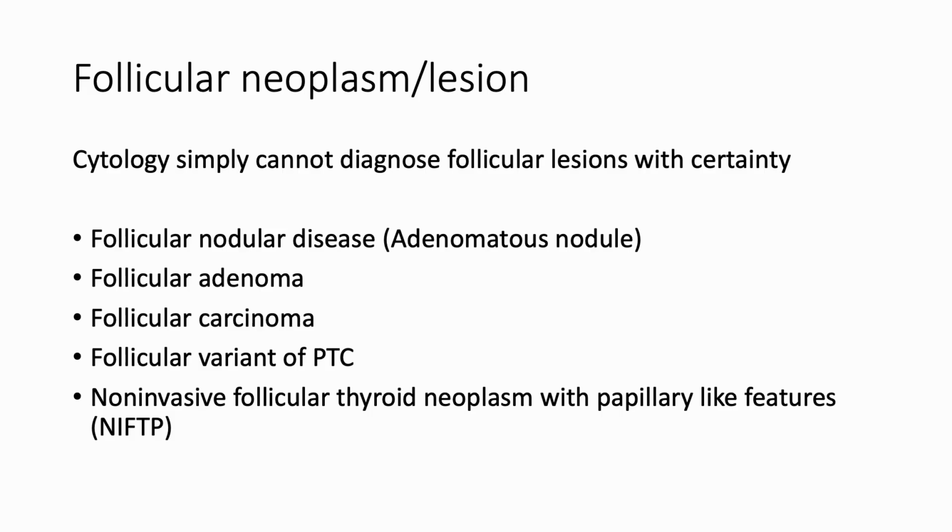When we use the term follicular neoplasm in cytology, the differential includes follicular nodular disease, follicular adenoma, follicular carcinoma, and NIFTP, non-invasive follicular thyroid neoplasm with papillary-like nuclear features, and sometimes follicular variant of PTC. Yes, it's a long list, and not always helpful clinically. The brutal fact is that cytology cannot diagnose follicular lesions accurately.